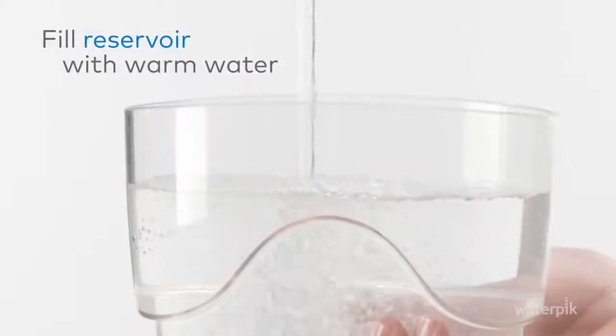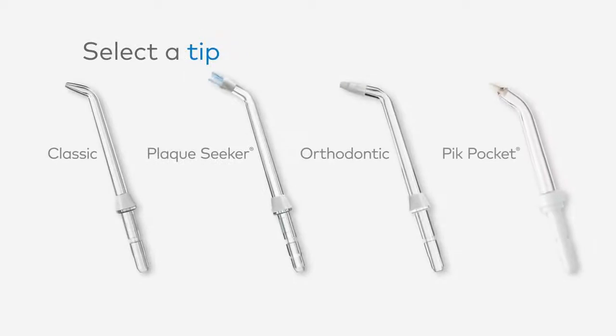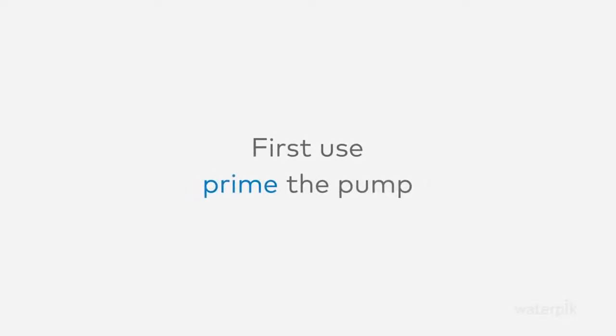Fill reservoir with warm water and place firmly on the base. Select a tip that's right for you. Click firmly into handle. If this is your first use, you'll need to prime the pump.